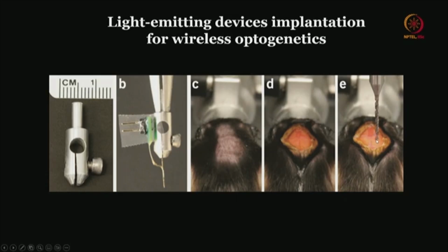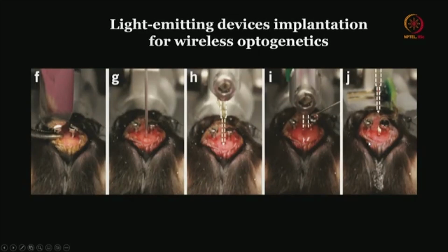So again the basic principle is making a burr hole and then breaching the dura, and once the burr holes are made, the first thing, as I said, is to implant the screws to aid in rigid fixation. Once 2 screws are implanted and screwed in, as I said, leave enough space between the skull and the top of the screws to hold the dental acrylic.